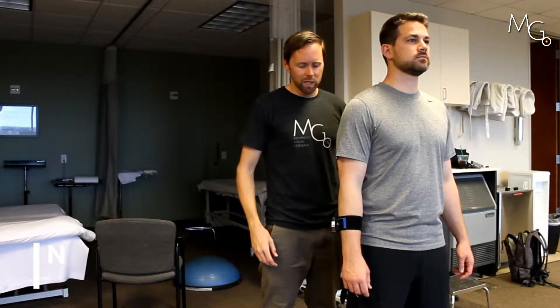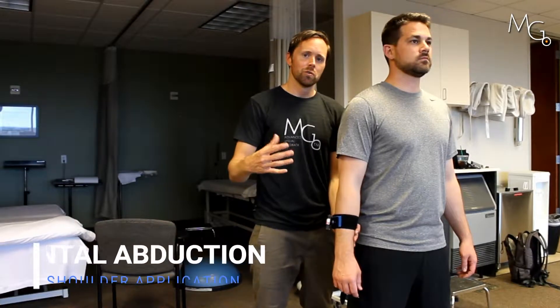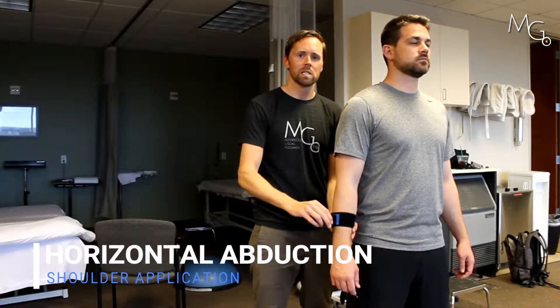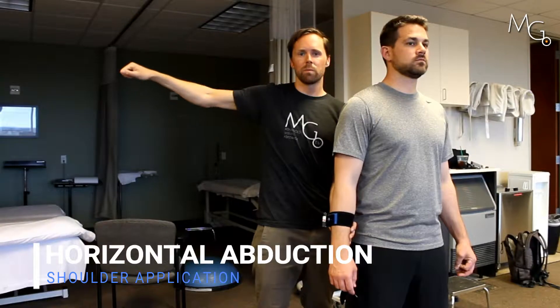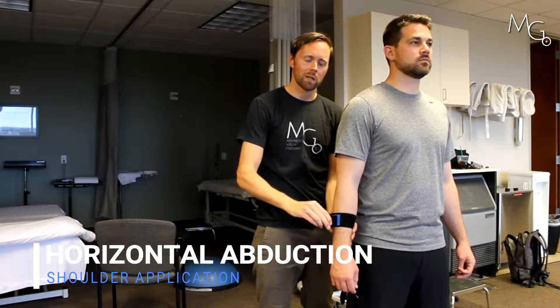If we're going to work on abduction range of motion, I can use the ball and socket on the laser to try to adjust how much Chris needs to be moving into either horizontal extension or flexion. Often people are either restricted, painful, or tight moving into horizontal extension, so we can adjust this based on what they can do.